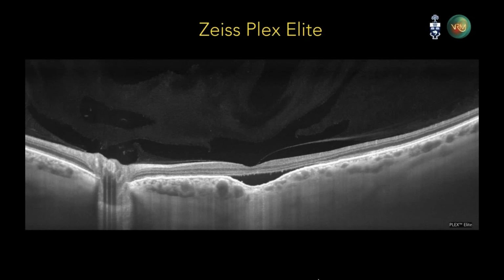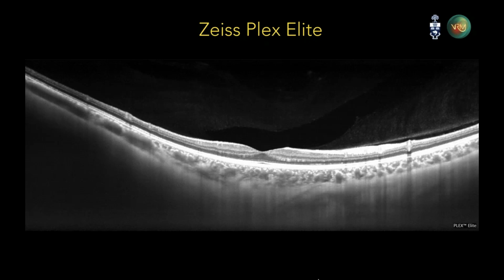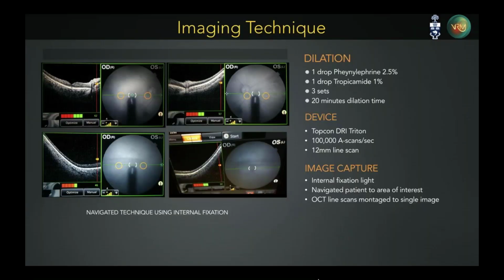And then also, from the perspective of what the device does, this device just does OCT, whereas the Triton does the full perspective of retinal imaging, from color photograph to fundus autofluorescence to fluorescein to OCT, en face OCT, and OCT-A, as well as anterior segment OCT. So, I think when you look at devices head-to-head that are in a similar class, that is Swept Source, it's important to recognize the major differences. And really, the Triton is an all-rounder that does everything that a glaucoma and/or retina and/or generalist or optometrist would potentially want in their practice, versus a research-only device, which has just one capability.